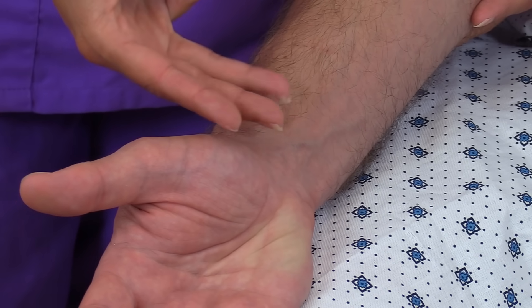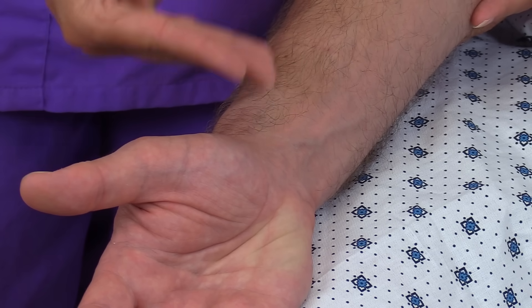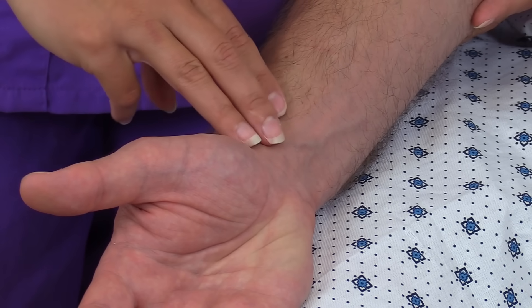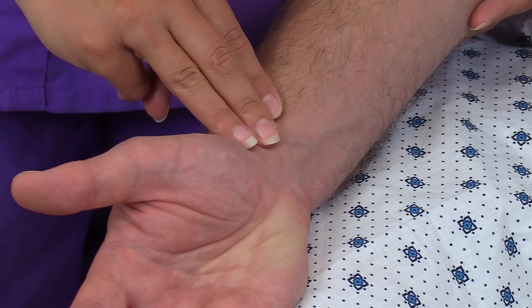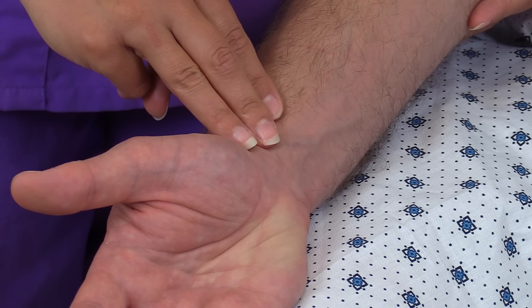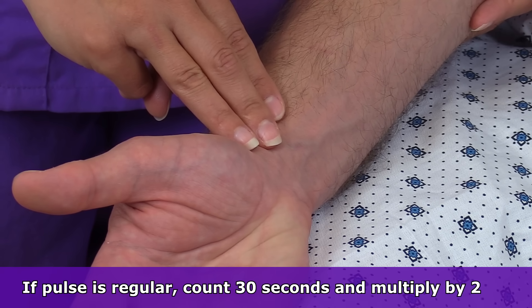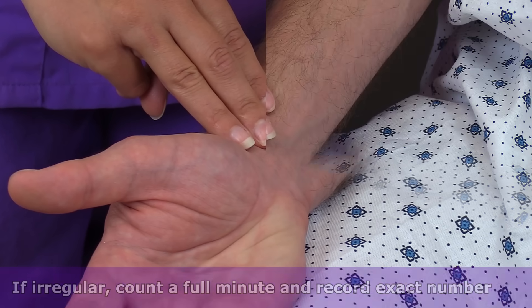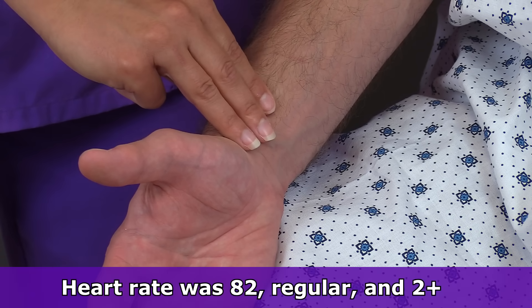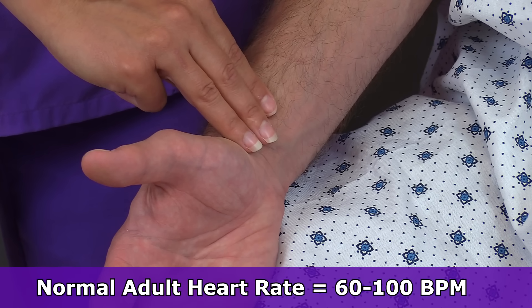Count the pulse for 30 seconds if it's regular and multiply by two; if it's irregular, count for one full minute. His heart rate is 82, it's regular, and it's two plus. A normal heart rate in an adult is 60 to 100 beats per minute.